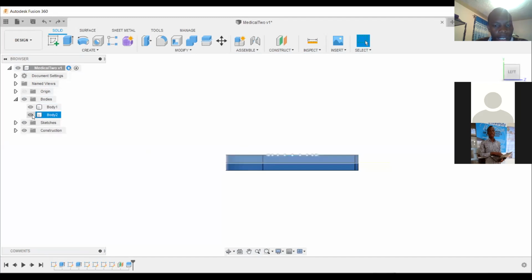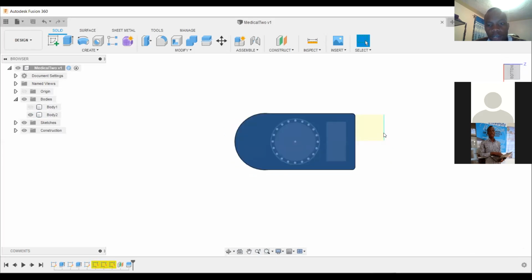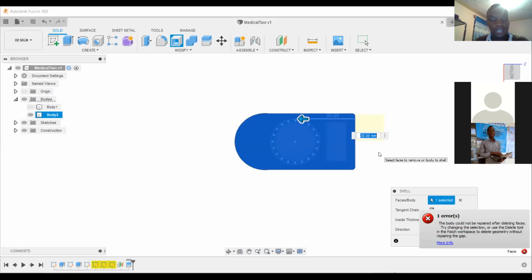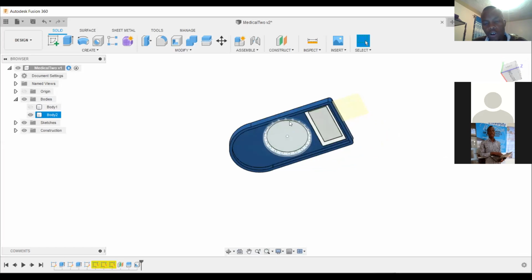So I want to show you something here. Like let's hide the bottom one. So it ought not to have appeared this way. I drew 2 lines. So that is why. So if you draw 2 lines, it will give you trouble. So you can always shell with like 2. So it is hollow. To shell is to make it hollow inside.